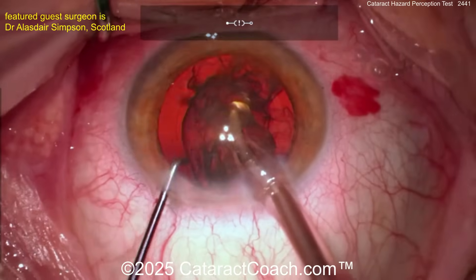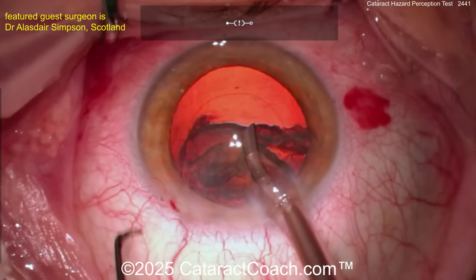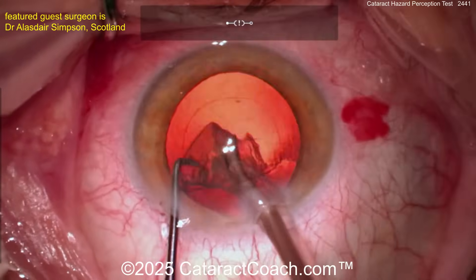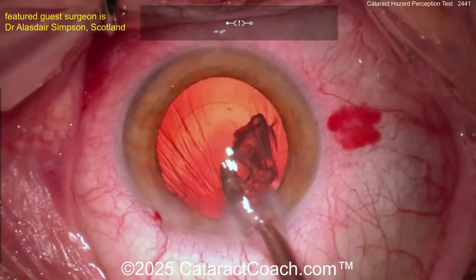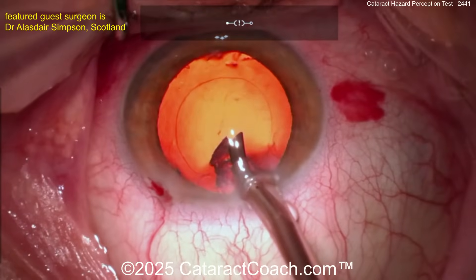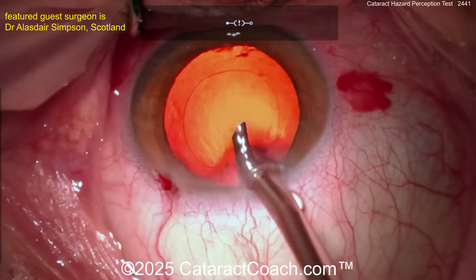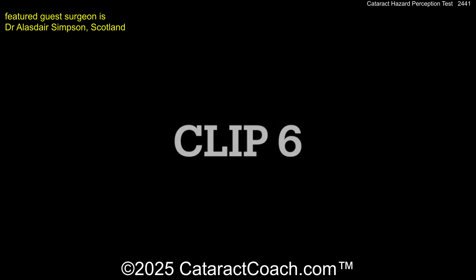Clip five — taking out the rest of this little epinuclear shell, that comes out pretty easy. And then whoa — you're losing infusion! Put the probe back in the eye. The probe came out of the eye, it lost infusion. You could easily puncture the capsule like that. You need to keep the infusion in the eye. Why are you not using your second hand to help you? Is that a hole in the capsule? Maybe not — maybe you got lucky. That is the probe coming out of the wound.